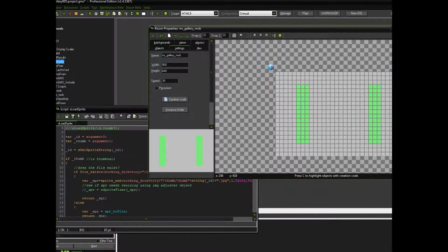It may seem daunting to the uninitiated, but I have very minimal training in software design, and I found this very easy to use. There's an extensive drag and drop interface where you can just place objects, such as buttons, onto the screen, and the left-hand side shows the actual code, which is written in a pretty easy-to-pick-up scripting language. Using this platform, I designed Atlas software that can pull static images from a folder as they are referenced by a rudimentary relational database. Let's take a look at the front end first.